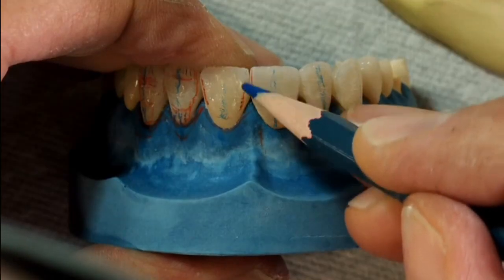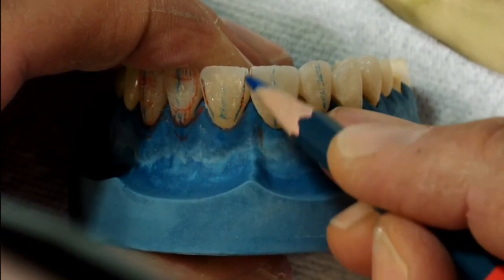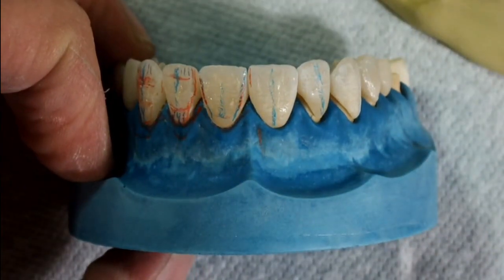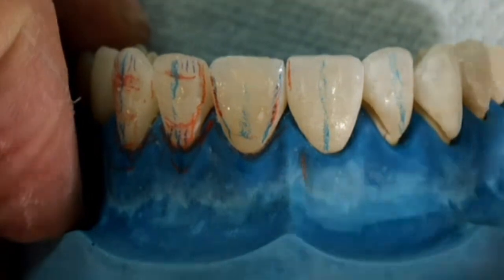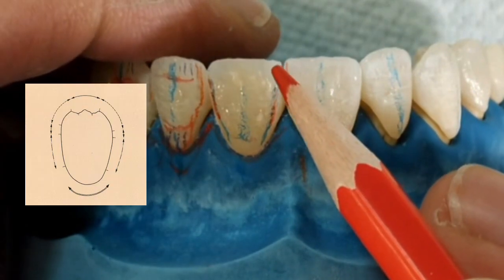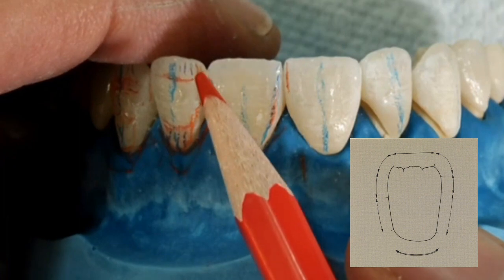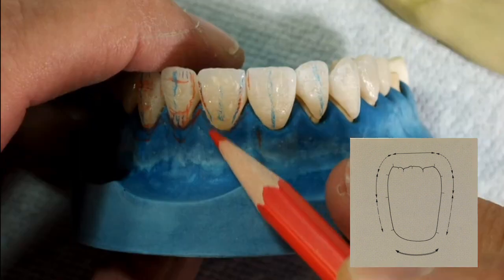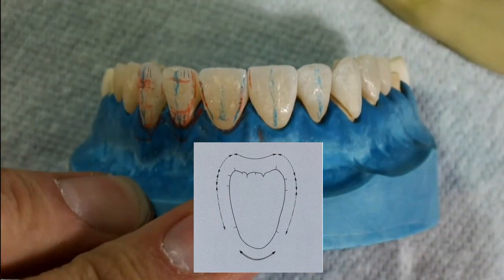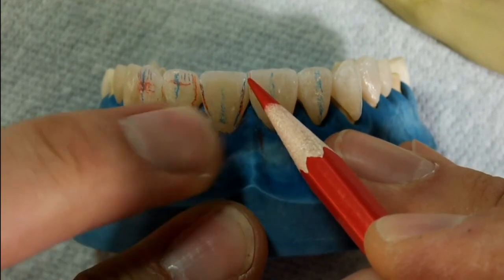Now we can begin to draw on the line angles on the tooth. Each tooth shape — oval, tapered, or square — has certain characterizations of the incisal edge. On an oval tooth, the mesial and distal corners are both round. On a square tooth, they are both square. On a tapered tooth shape, the mesial is more square and the distal incisal edge is more rounded.